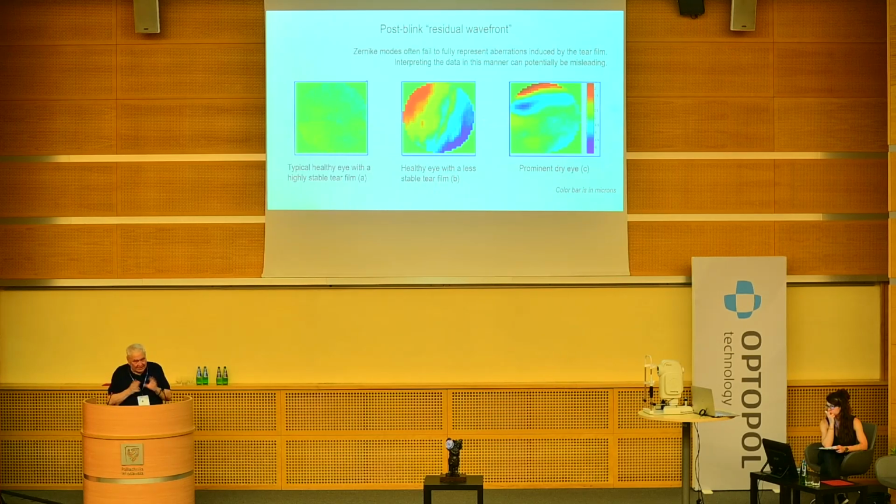And they made the experiment following the frames, like usual frames after blink: 1, 2, 3, 4, and they see that this residual wavefront is changing, varying.